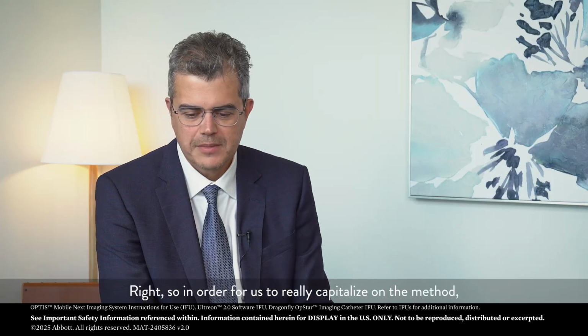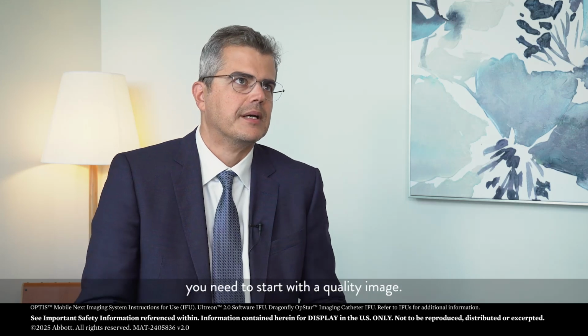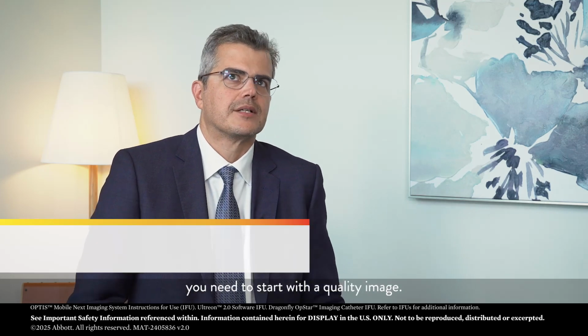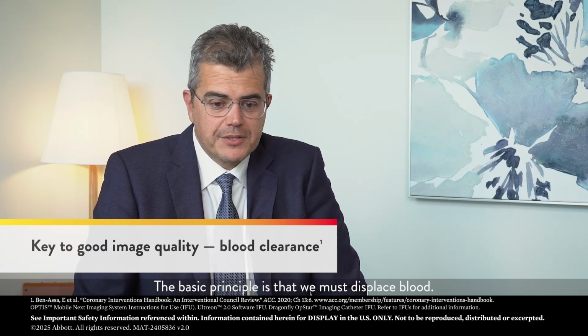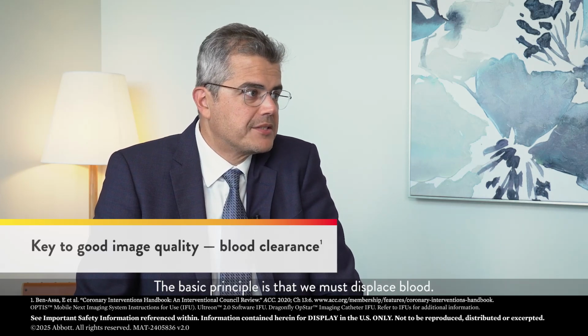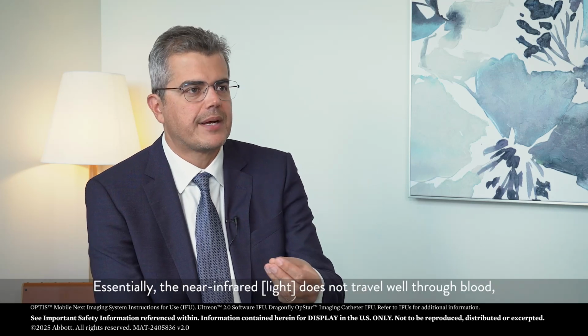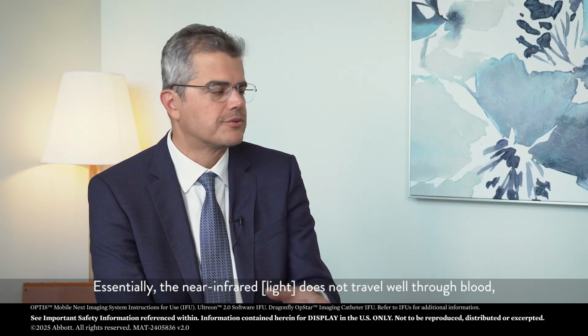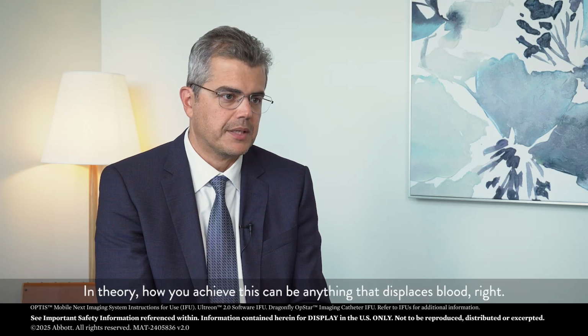Great. So in order for us to really capitalize on the method, you need to start with a quality image. The basic principle is that we must displace blood. Essentially, the near infrared does not travel well through blood. So you need a blood-free environment. In theory, how you achieve this can be anything that displaces blood, right?